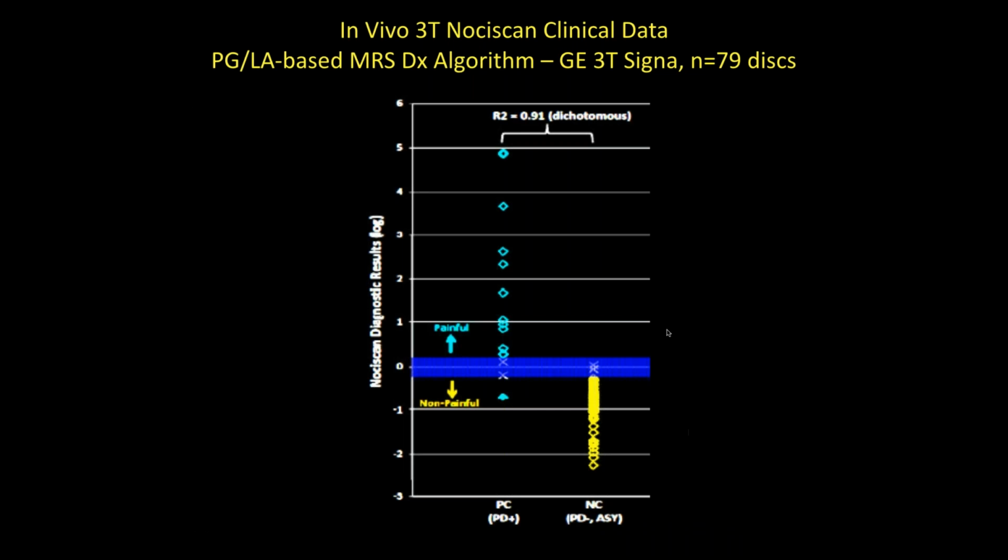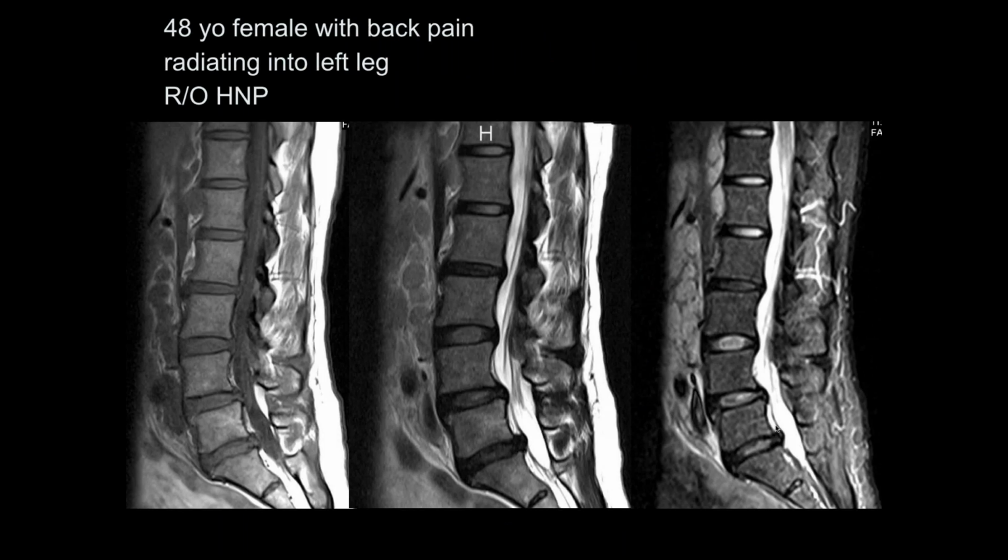And some of our data was in this. This is from NociScan, which is the company that's really trying to market this right now. And they only had one where there was actually a misdiagnosis on the part of the MR spectroscopy.